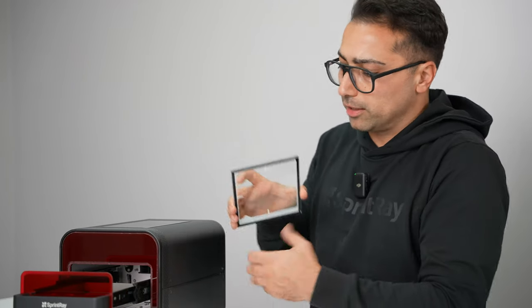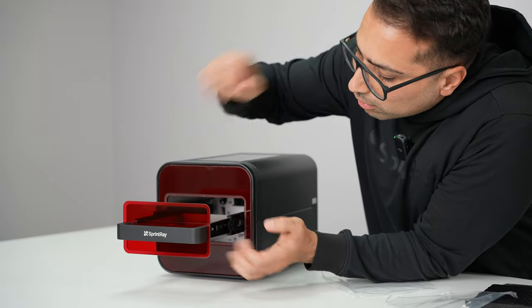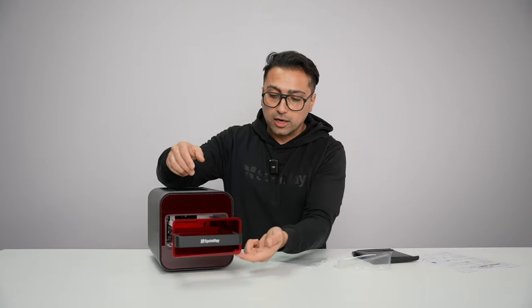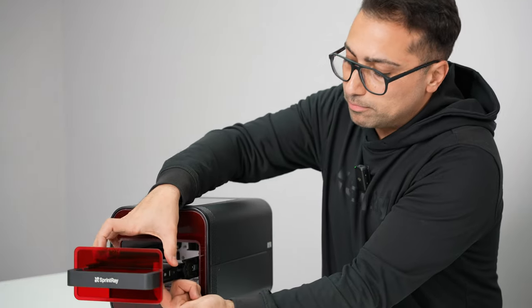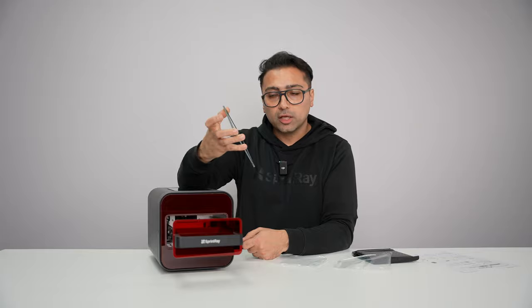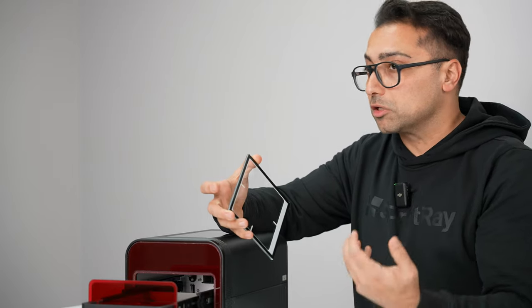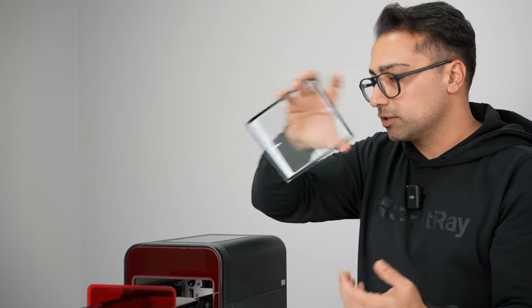So if you need to ever clean this, you can easily just take it out, clean it, and put it back in place. If you ever need to take it out, just lift it from the bottom and it comes out. You need to clean this frequently. Once it starts getting dirty, the LED sitting on the bottom — which is supposed to penetrate through the glass — is just going to get covered, so it's not going to cure as well. Make sure you clean this piece often.